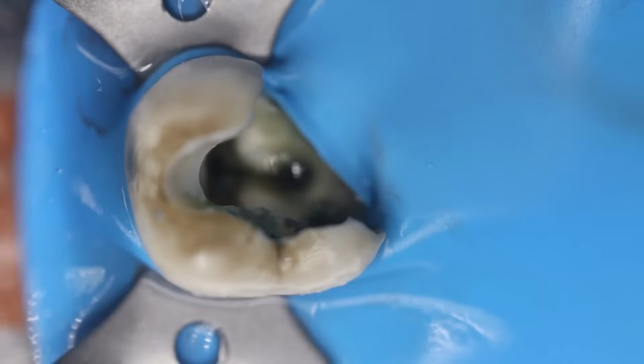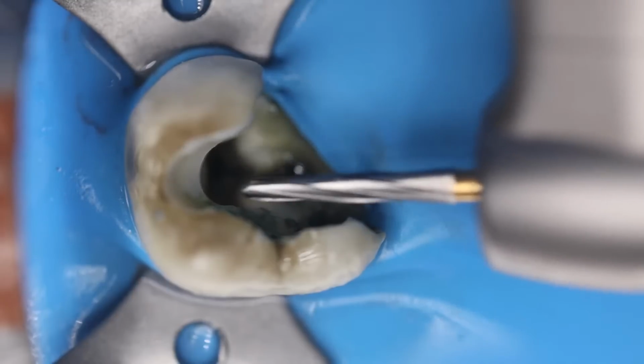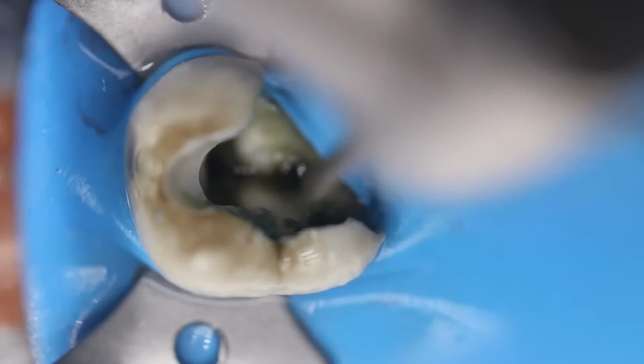Okay, now we can switch on to the Endo-Z bur or the safe-ended bur. Why? Because now we need to work on the pulpal floor and the orifices so that we can visualize it correctly and not perforate the pulpal floor. So we will just switch on to this Endo-Z bur as you can see over here, and now we can refine our access cavity.